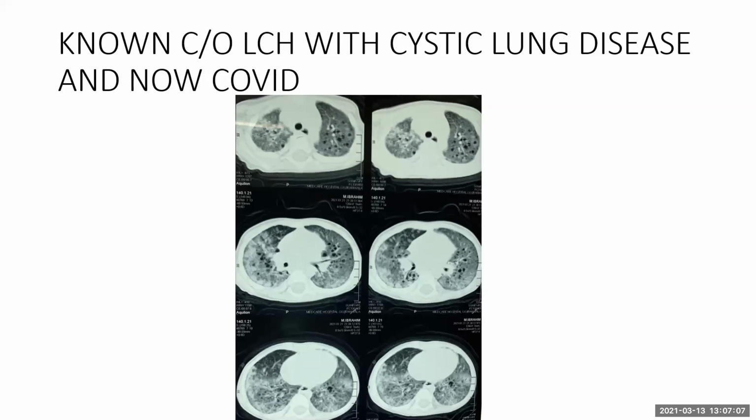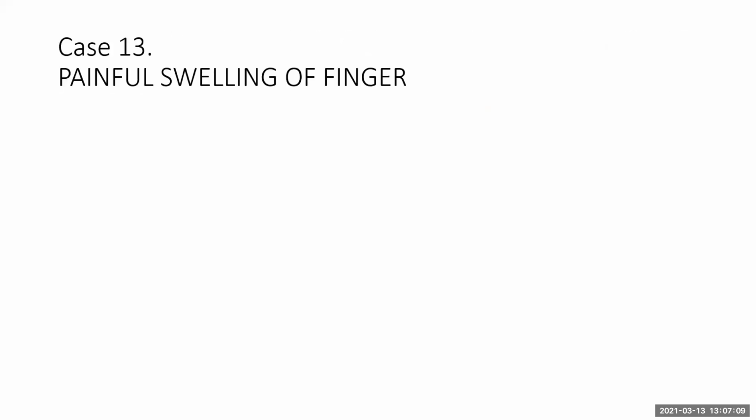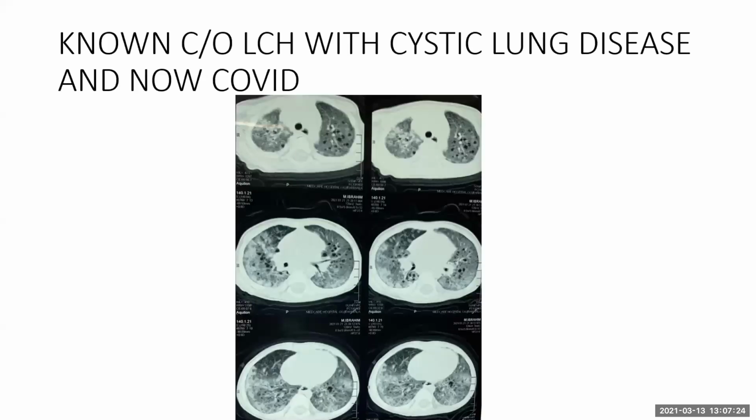Somebody has said diagnosis of chest CT. I don't know. We had multiple chest CTs, so I'm really not sure which one they're talking about. If this is the one, then you have already explained, I guess. Somebody said, can it be just congenital pulmonary cysts, madam? Congenital pulmonary cysts, yes, can be.